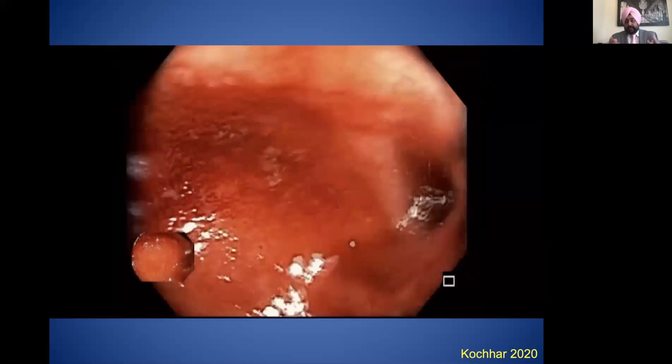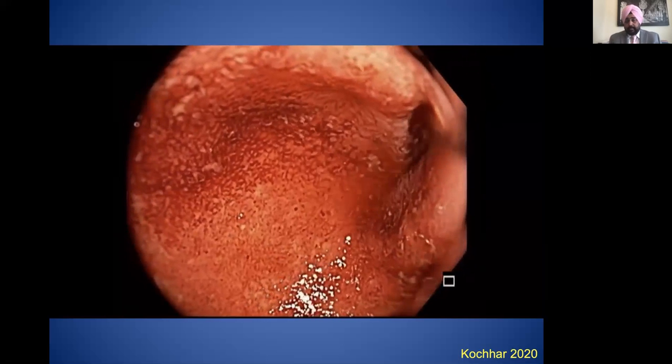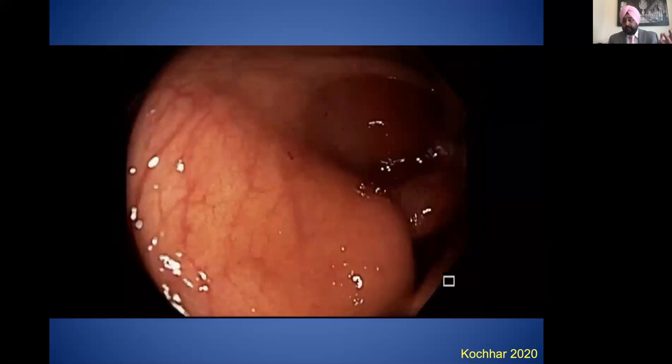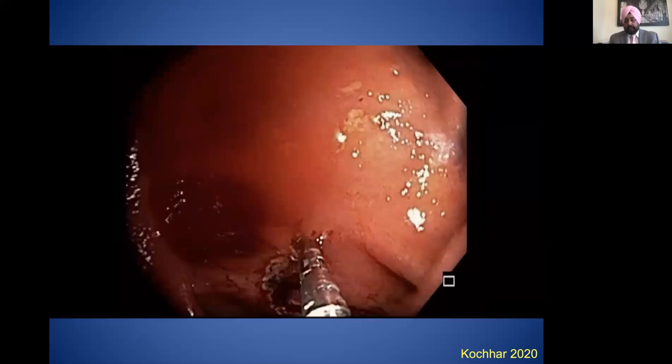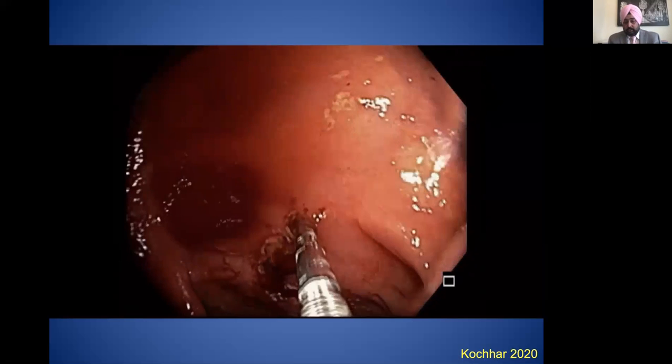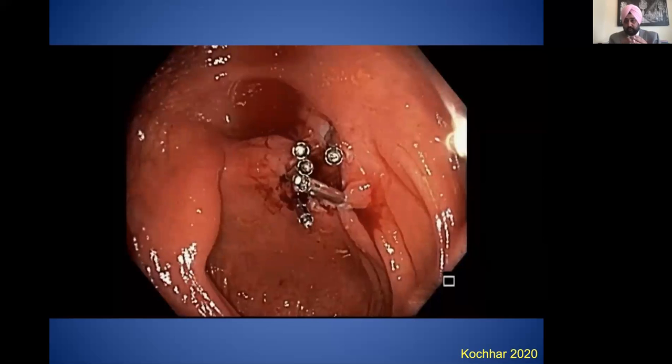And this patient again had normal mucosa, so there was no need for her to undergo a repeat surgery. As I also mentioned in the case, she was 9 months postpartum, so she wanted to avoid surgery at that time. And then we tend to close it with the clips. As I mentioned, clips work twofold. They prevent the edges from going back, and they also help with post-procedure bleeding.